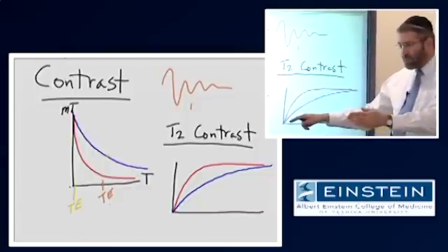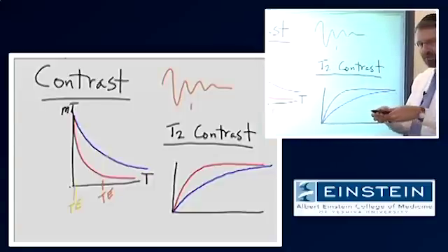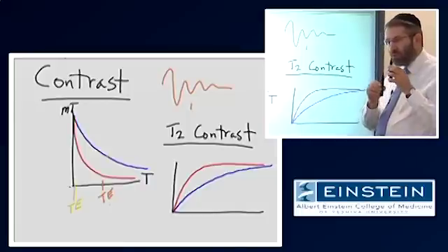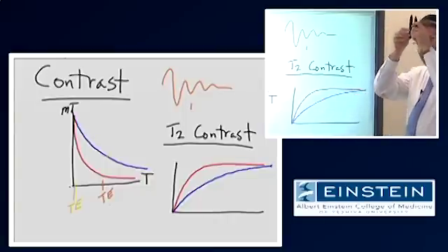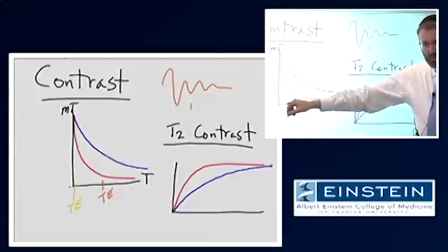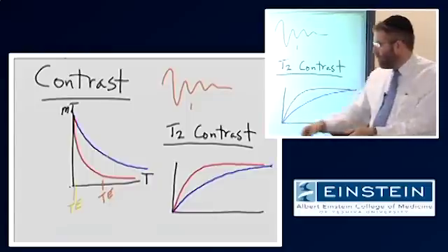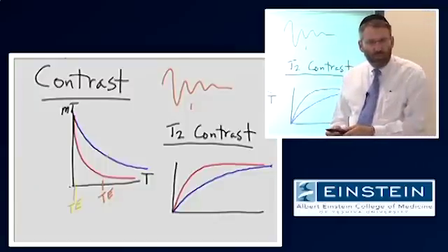Then what happens is we wait, and during this waiting period, there is relaxation of that transverse magnetization. At some point, we're going to measure it. During that time, there is also regrowth of the longitudinal magnetization. And if we wait long enough, all of this is going to fully relax and put us back to the same place we were right before this point in time. In which case, if we do it again, we put this back in the transverse plane, and we are back exactly to the same place where we started. Is everyone clear what I'm getting at here?